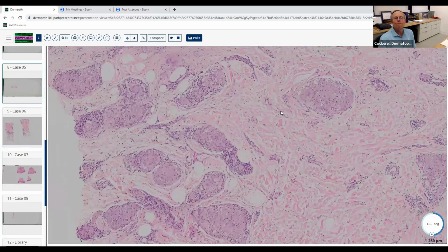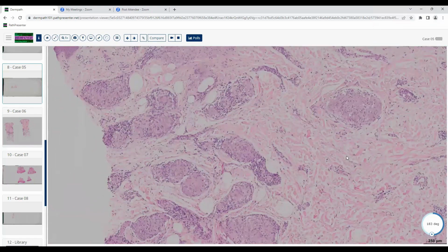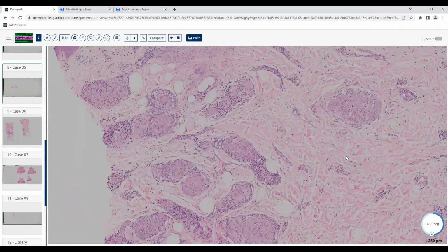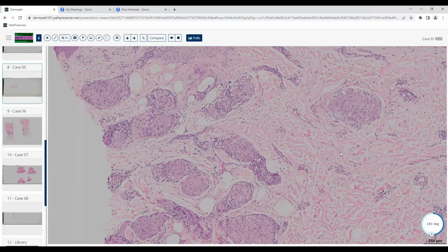It definitely would be. What else would you look for? I guess for the leprosy, that orientation, the east to west? Kind of, but let's say we don't think it's Hansen's. That's not following neurovascular bundles. There might be a little nerve twig left here. So we don't think it's Hansen's, so we're not going to choose that one. But sarcoid isn't in our list, so we have to decide what else can look a lot like sarcoid, but it isn't sarcoid.